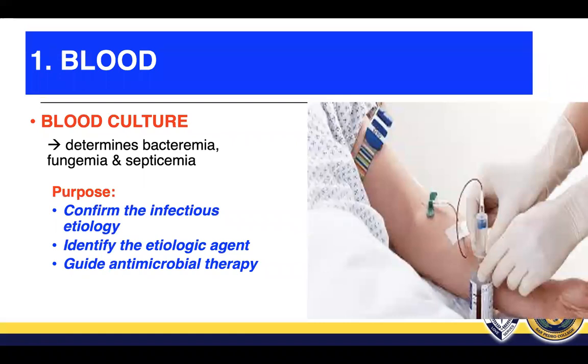Okay, so let's start with one of the most common specimens, the blood. Blood culture is defined as the collection and inoculation of blood in the culture media with the aim of growing pathogenic microorganisms to diagnose special cases like bacteremia, fungemia, and septicemia.